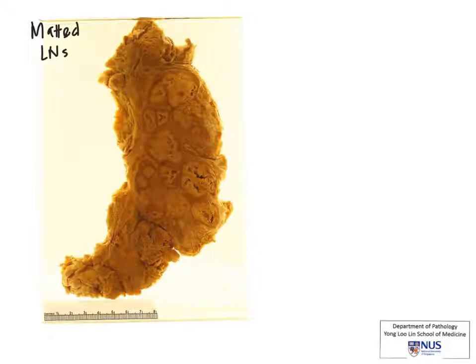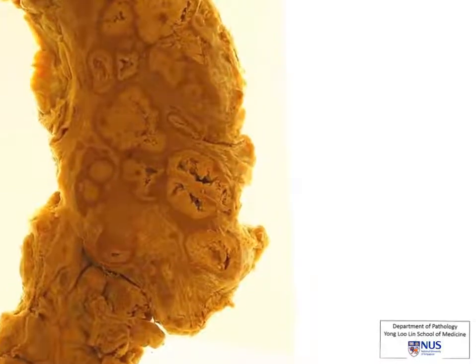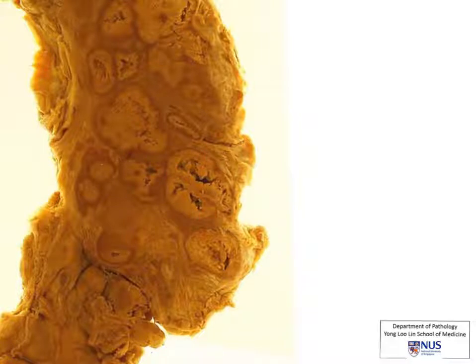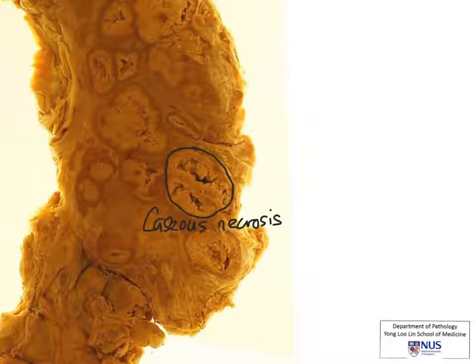Now let's take a closer look at the gross appearance. We can see that even within this nodal mass, there are some areas that show a different colour — here that I'm outlining, as well as here and here. They are paler, and there seem to be some areas of cavitation showing that this tissue is very friable. This is the gross appearance of caseous necrosis, and this is one of the key features of tuberculosis infection. Therefore, the diagnosis in this case is tuberculosis lymphadenitis.